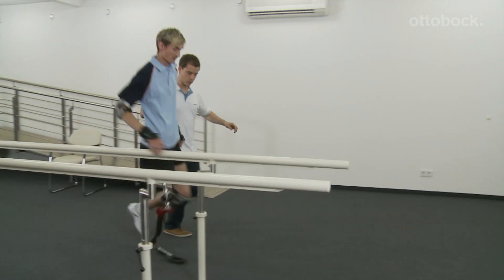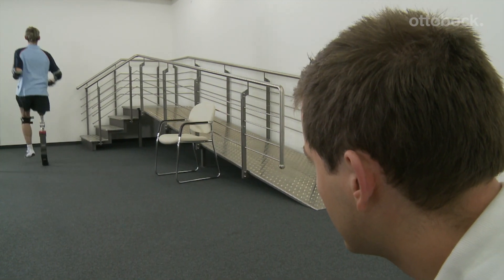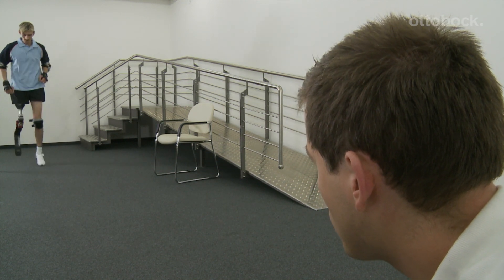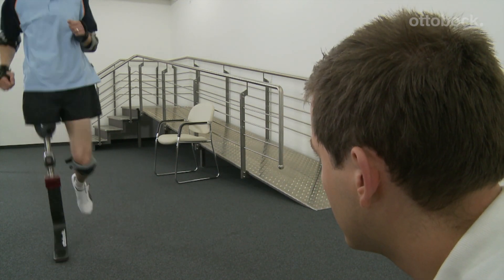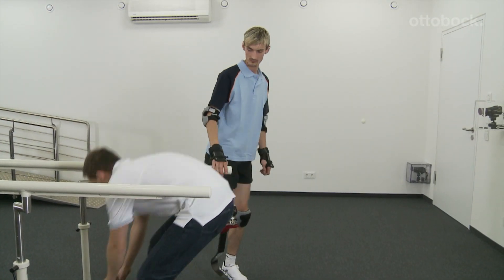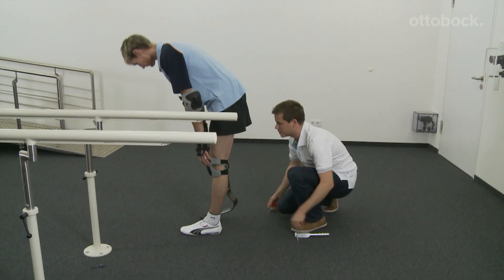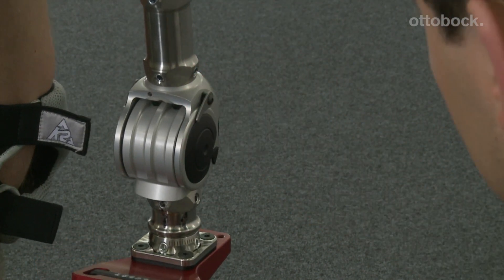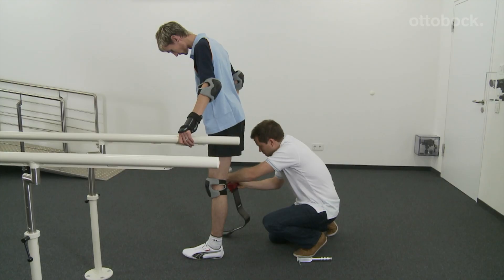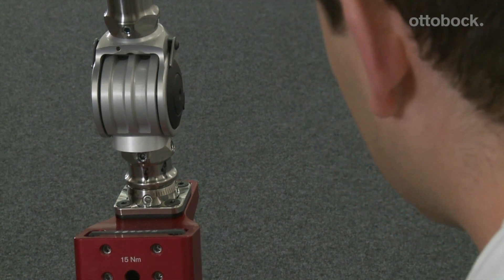If the user can run independently, it is time to check and optimize the dynamic alignment of the prosthesis. The motion with the prosthesis should be even and the entire surface of the foot should have contact with the floor. Under load, the foot must stand at a 90 degree angle. The swing phase should have a consistent rhythm. It is necessary to get feedback from the user for the optimal adjustment of the damping resistance values. Proceed with caution, since even minimal adjustments can have significant effects.